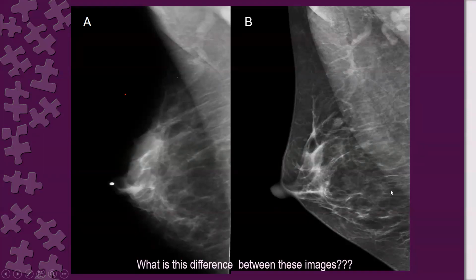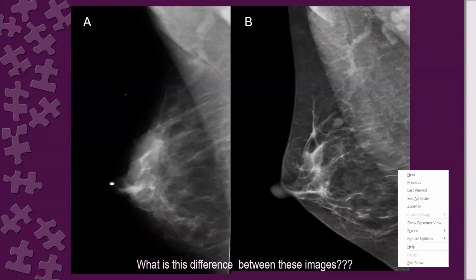So can you tell me again the difference between these two? Again, can you see how detailed the image is here? Contrasty. This is very good contrast. Is the digital one the right or the left? The left looks conventional. Digital is on the right side of the image. Yes, this is good contrast and this is low contrast. Even the contrast resolution and the spatial resolution are much better on the digital image.